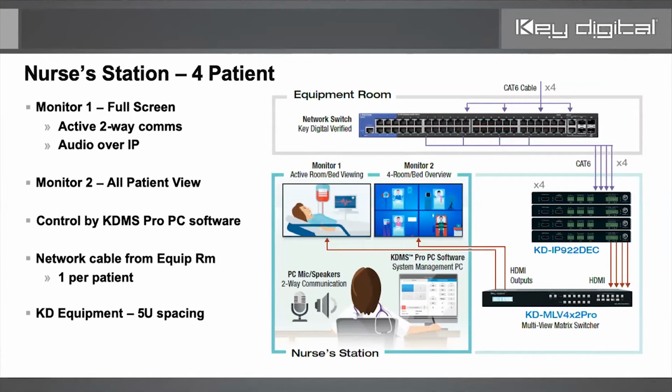But since we want those feeds to go on 1 monitor, the MLV is essentially a tiler that creates a virtual video wall tiling system within 1 monitor, if that makes sense. This is also very good to demo on the road for customers who are looking to create a video wall, but you want to do a quick demo with 1 display so they understand how a video wall would function. But that's a little bit of a digression.